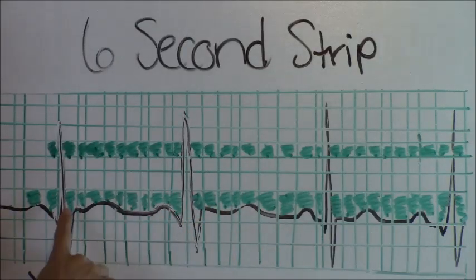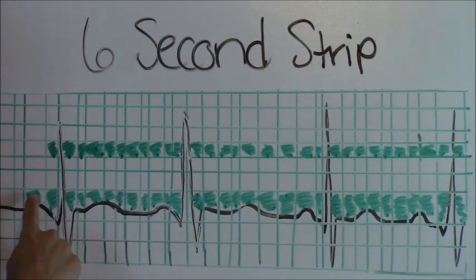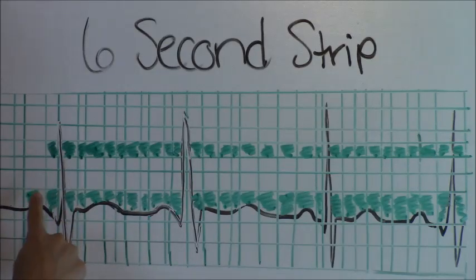So to use the 6 second rule, we're going to start right where the P wave is and start measuring the large squares and count until we get to 30 and stop and see how many P waves are in between those 30 squares. So let's start counting.